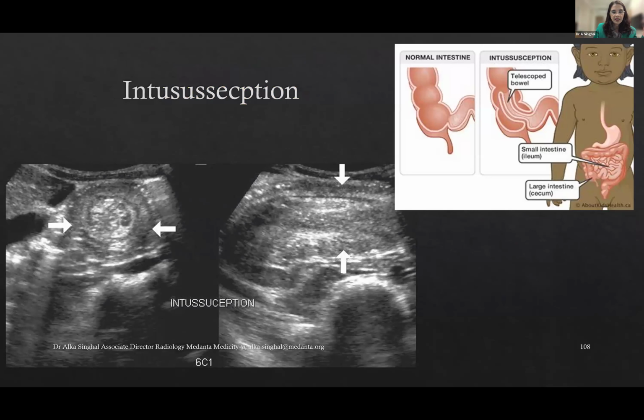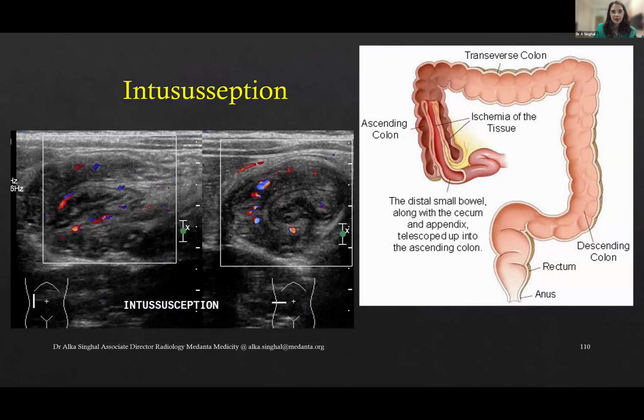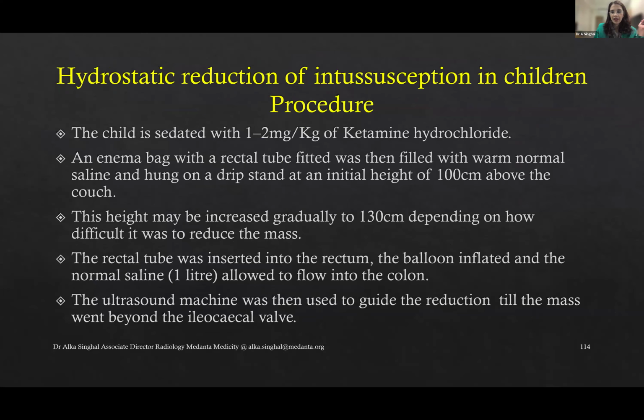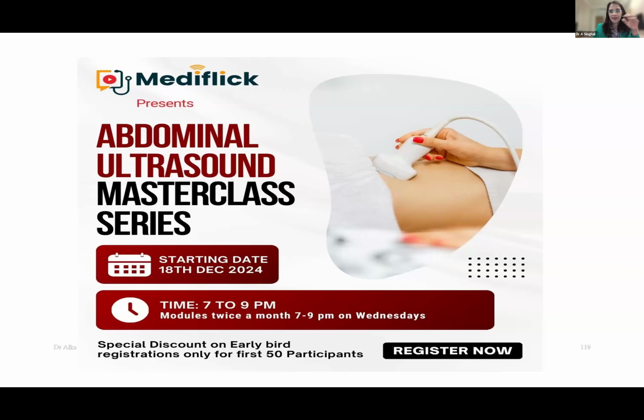So again, you can have these leading to intussusception. You can go for a hydrostatic reduction. We will leave that for this course. We'll, of course, discuss all that in the detailed class, right?